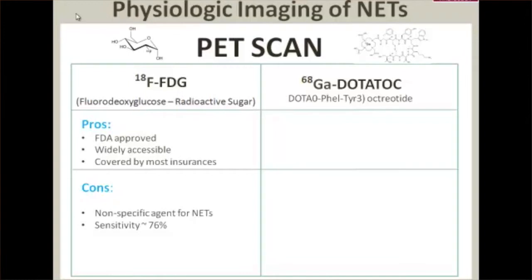FDG is what I call spy sugar. It's a sugar molecule that has basically had one of its groups pulled off and a radioactive guy stuck on. So to your cells, this looks enough like sugar to get into the cell. Once it's in there, though, the cells realize that this is a poser, an interloper, and they can't use it. However, it's a little trickier spy sugar because it doesn't let the cell kick it out. It's like that relative that doesn't really leave after dinner's done. You can't actually get them back out.